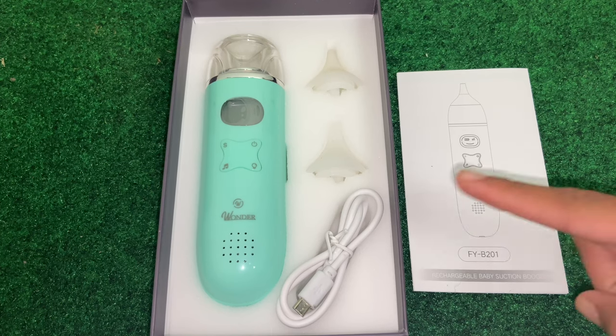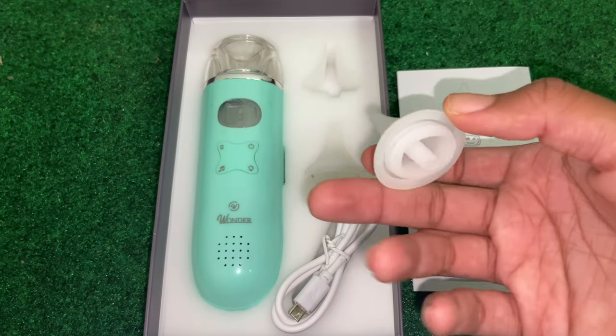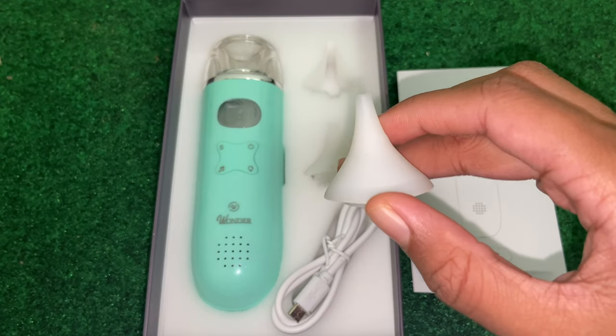As we open it, the first thing we see is our device at the very top. We then have our instruction manual, a USB port for charging it, and two nozzles that go at the top — made of a nice soft gentle material so it won't hurt the baby.